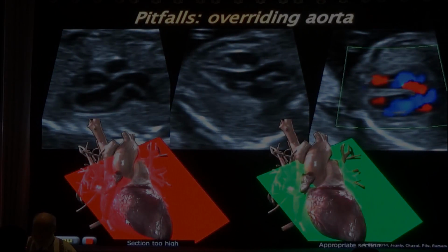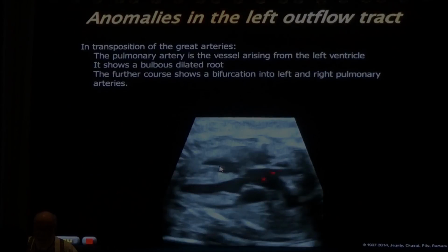This is just the bottom of the pulmonary, and so it returns no echo. And here I have corrected the section and I moved it down below. So be careful about that, because this gives you a lot of false ventricular septal defects. This is a common reason for overreading them, and you have to do Doppler on this image to make sure that this is correct or not. So be careful with this image.